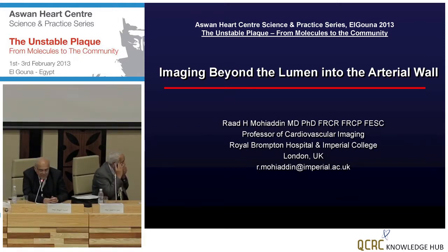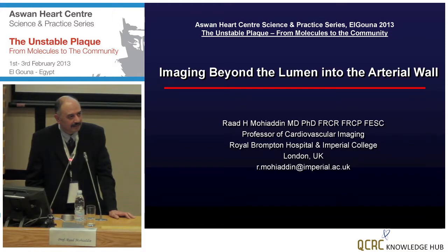Does this help in knowing the calcification degree and the nature of the lumen wall, or it doesn't help in this? No, I think, as I said, soft plaque, non-calcified plaque, is more vulnerable to rupture and events compared with the calcified plaque itself.